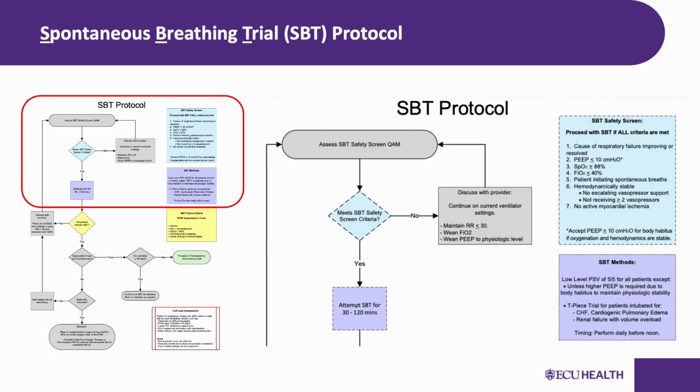Patients who were weaned without using the RSBI as a decision point did just as well as those who had it measured. A 2022 systematic review and meta-analysis published in CHEST, which is one of the largest analyses on this topic, looked at 48 studies involving nearly 11,000 patients. They found that RSBI had moderate sensitivity but poor specificity for predicting extubation success.